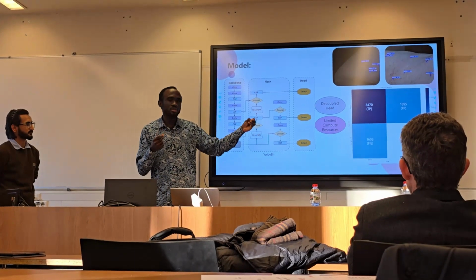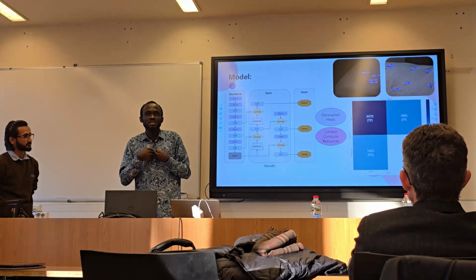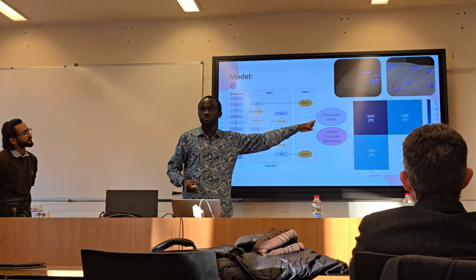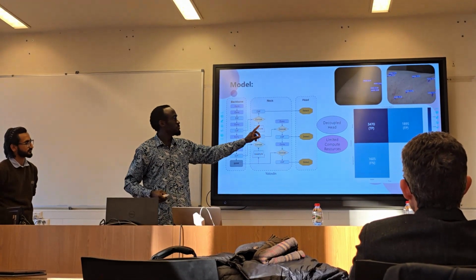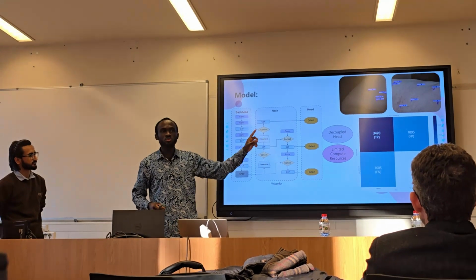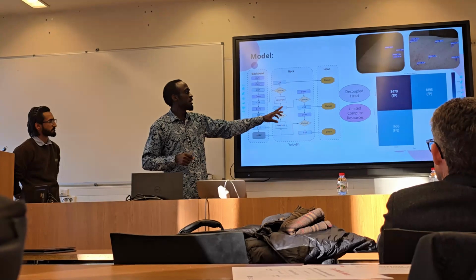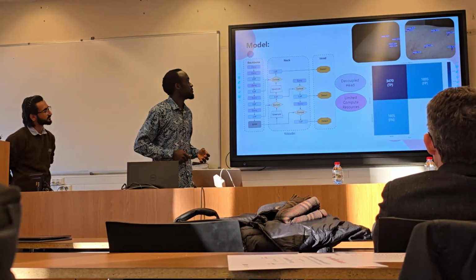We don't want to miss a patient with lesions while our model is predicting that they are not lesions. The other problem is the false positives, where the model is predicting that they are lesions, meanwhile they are not. So we need to work on this false negative and false positive to have more detections.